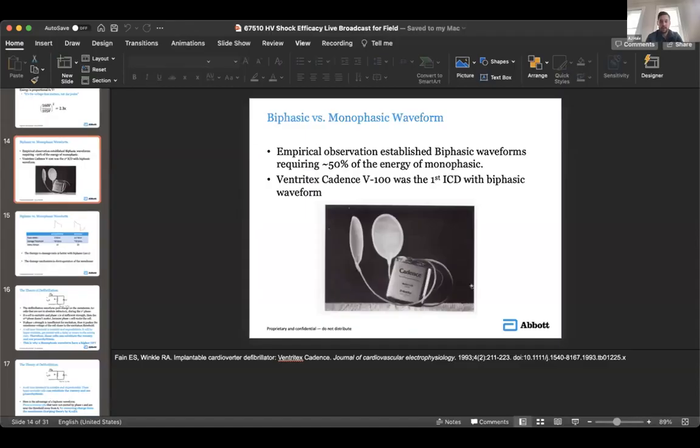Thank you. You were talking about when the chest is open, you may have seen some of these in the past too. If patients' chests are already open, they may choose to implant. Yes. We don't have them in Nigeria. We don't have them here. You don't see them much in America either. It's pretty rare. A lot of times we implant them transvenous. But back in the day, people used to do that.